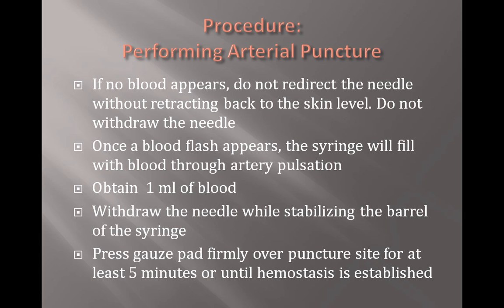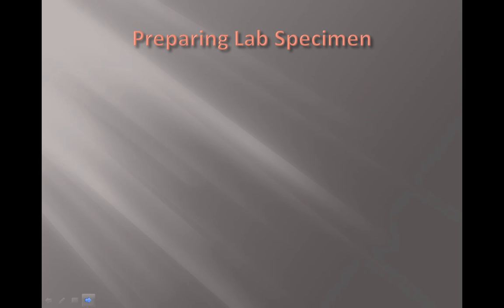Press a gauze pad firmly over the puncture site for at least 5 minutes or until hemostasis is established. Never ask the patient to assist in applying pressure. Their condition is unpredictable, and this practice may leave them vulnerable to bleeding and to hematomas. So great, now you have your specimen.